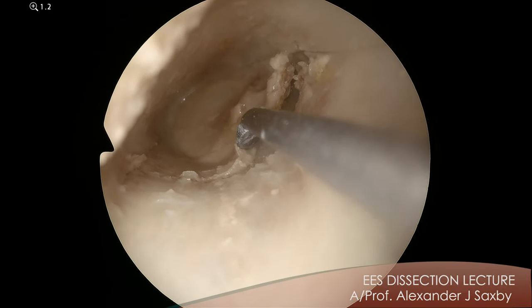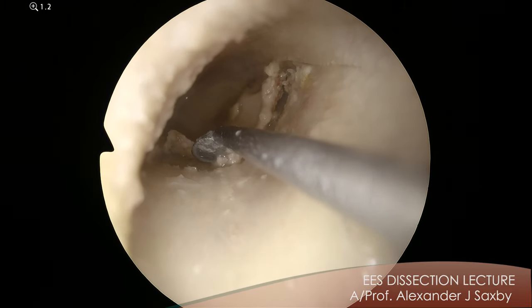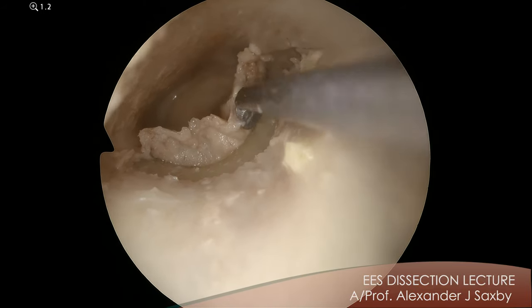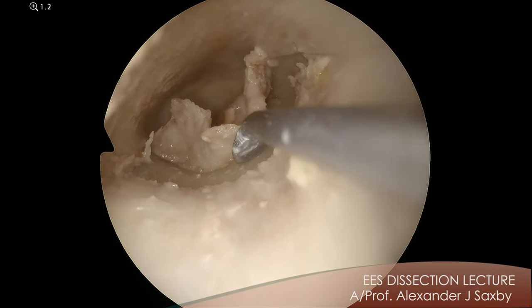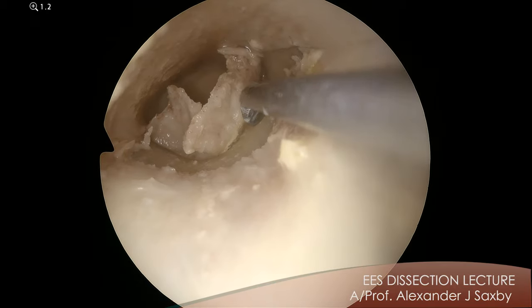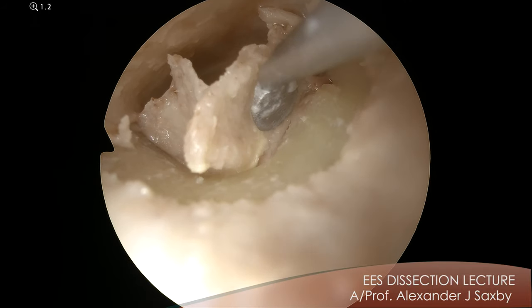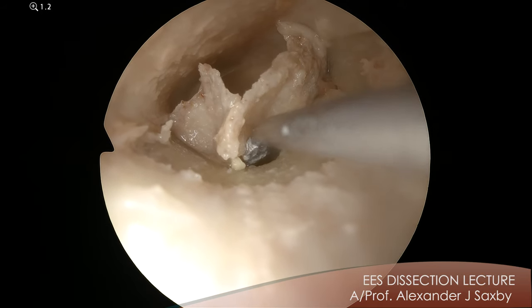Always operate on a broad plane, never in the pocket. You want to operate across the flap and slowly but surely work your way down. I prefer just to use a suction round knife, but you can use a neuropaddy and place it above to collect blood. Broad plane, broad plane, broad plane. Reflecting back. When you start to get to the annulus, come in close because then you can see the subtleties. Can everybody see the fibrous annulus there? This white line here. You want to be under that, you want to be on bone. So in we go to the middle ear, staying hard on bone.